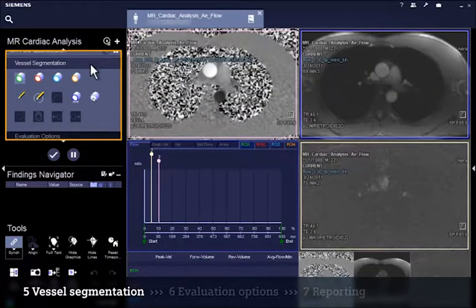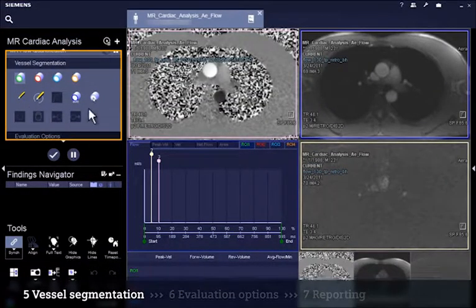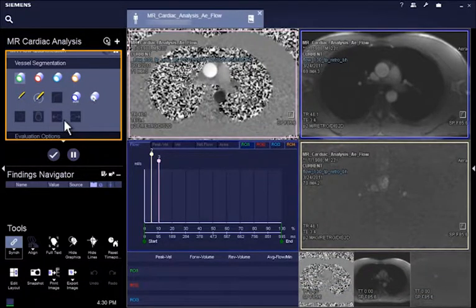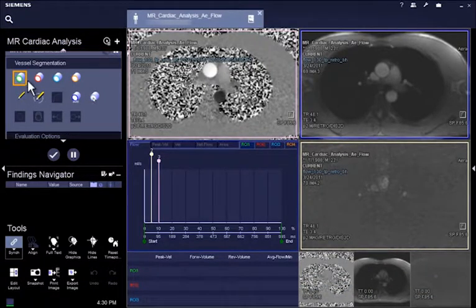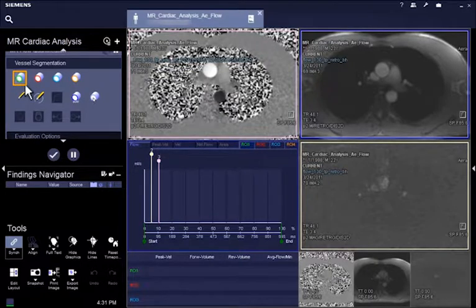In the vessel segmentation step, you will find all necessary vessel segmentation tools to obtain quantitative flow results. You are able to evaluate up to four vessels in any single data set, and by default, ROI1 is already active.